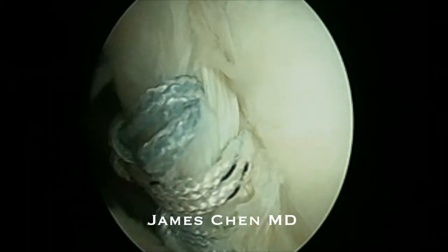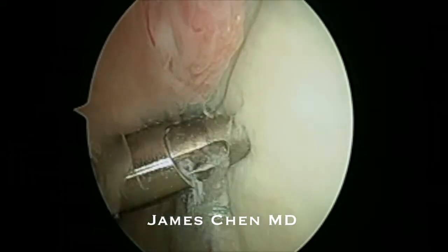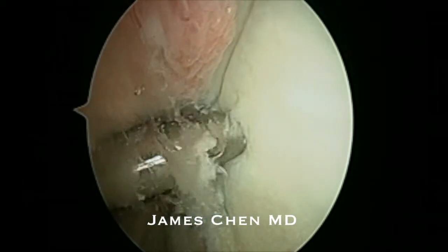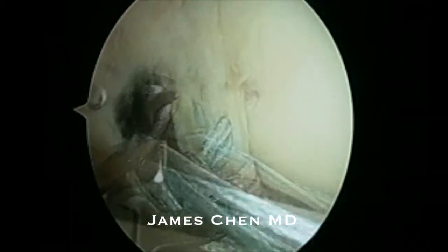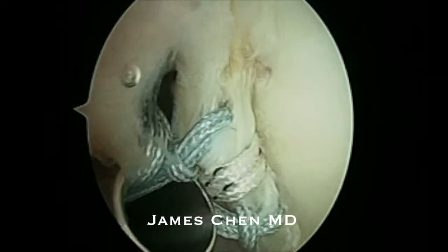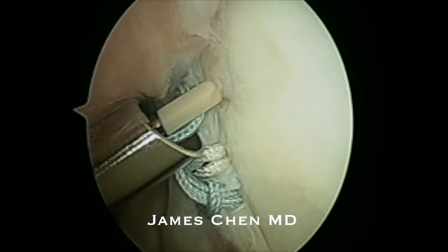In this technique I'm using two portals. Here I am drilling a pilot hole for a 2.9 push lock. I'm then retrieving the sutures through an accessory posterior portal.